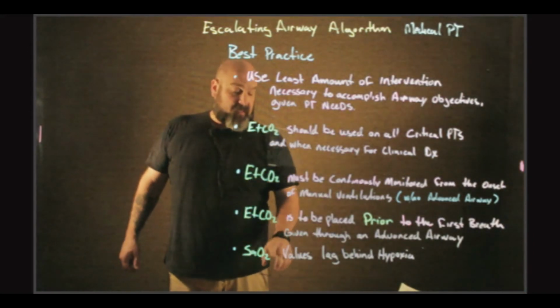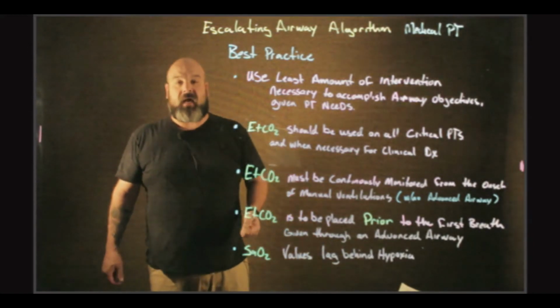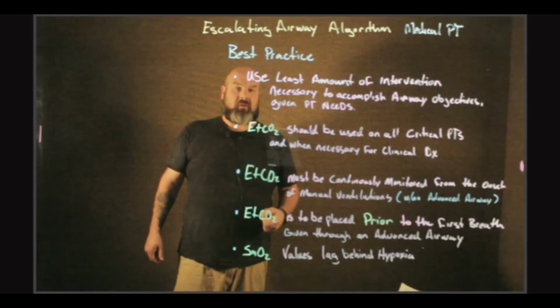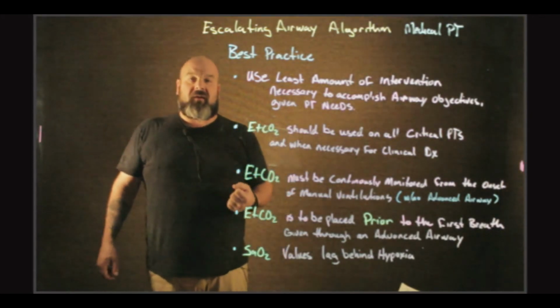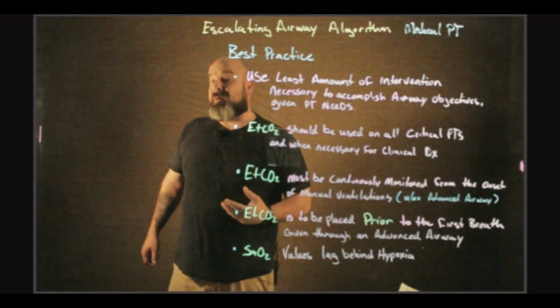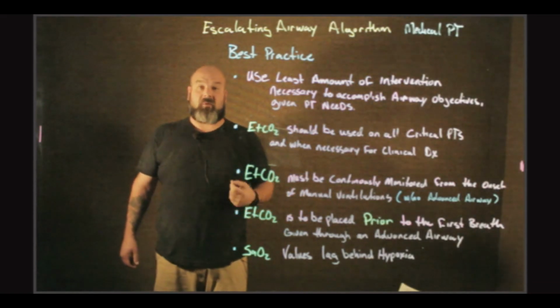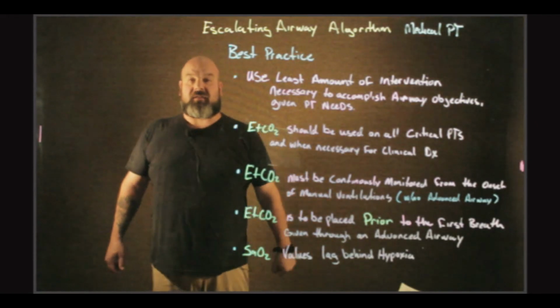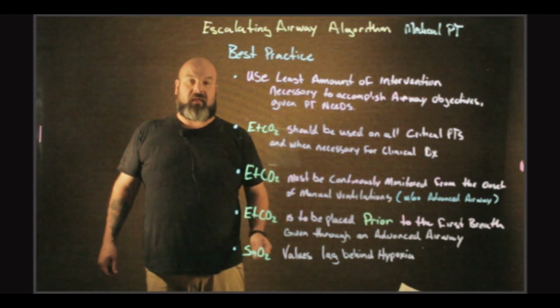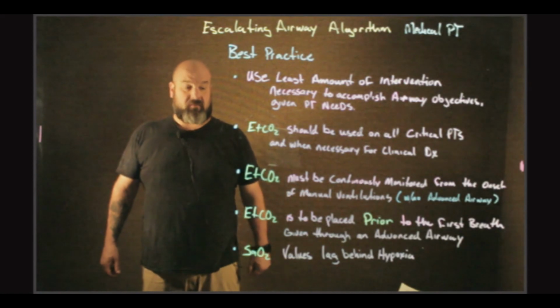Also, SaO2 values tend to lag behind actual hypoxia. Pulse oximetry values tend to lag approximately up to 2 minutes behind what the body is actually doing. This is good for trending, and end-tidal CO2 is good for immediate indicators of status.